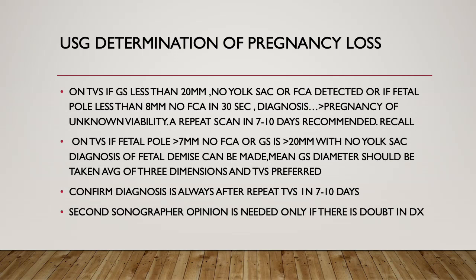There are certain parameters, like the size of the gestational sac and the presence or absence of fetal cardiac activity, which determine the pregnancy outcome.